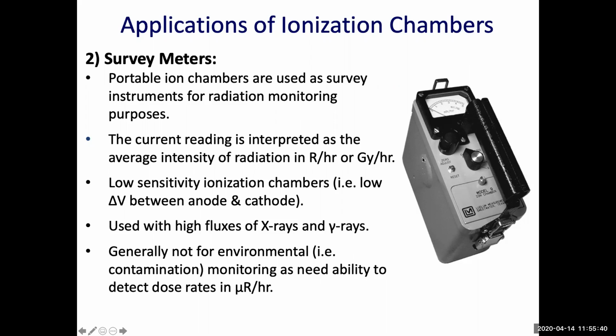If you have radionuclide on the surface, you have contamination, and it is not recommended to use the ion chamber survey meter to detect that, because the efficiency of the ion chamber is very low. It will not detect very low activity. There might be contamination on the surface, but the survey meter cannot detect it. We'll come to another kind of survey meter that can detect contamination.